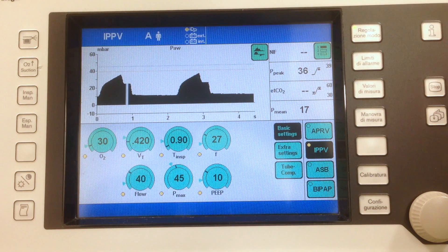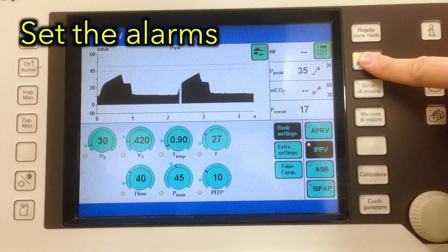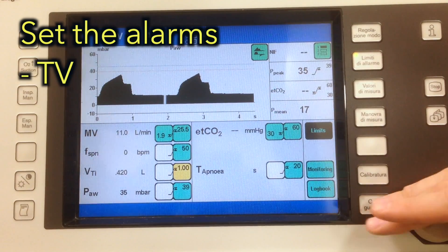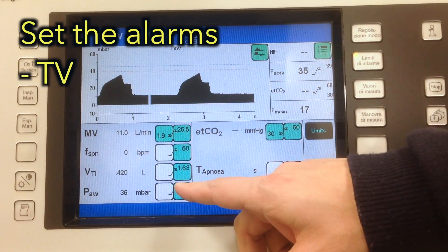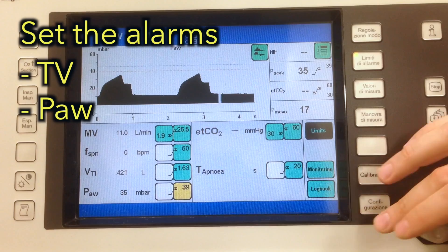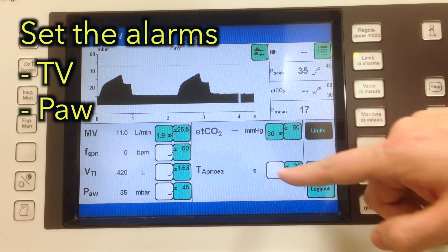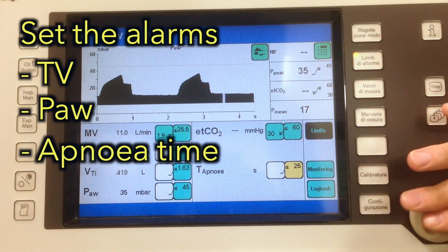This is how we perform a sustaining pressure recruitment maneuver with the Draeger Evita 4. First, we set the alarms. Set the tidal volume alarm to a volume that you consider safe for recruitment. Set the airway pressure alarm to a pressure of 5 cm above the pressure you want to use. Set the apnea time longer than the time you want to recruit for.